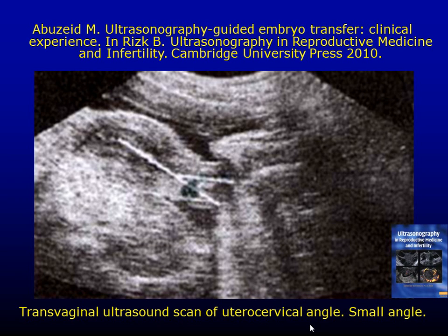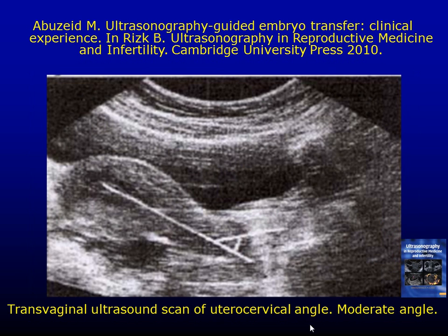Excessive distension adds no value. Little distension is not good enough. So what do I mean by little distension? When the bladder fills, the bladder fills till here and it keeps going out. And then this is another angle here. So with this angle, and again, beautiful pelvis, she doesn't have any adhesions, but look at that angle.